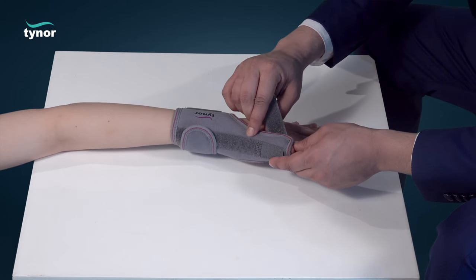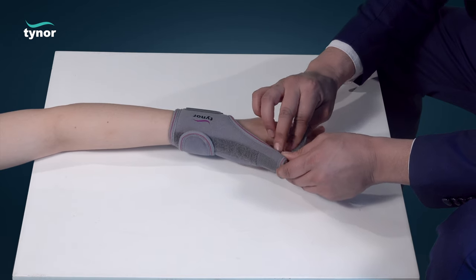Align the thumb portion of the thumb spica and fasten the hook loop fasteners.